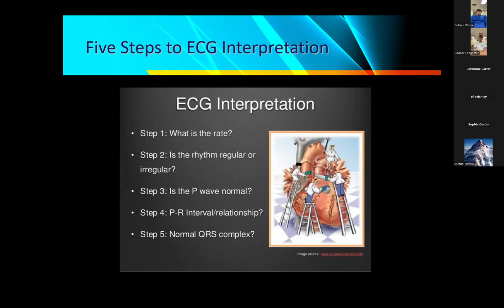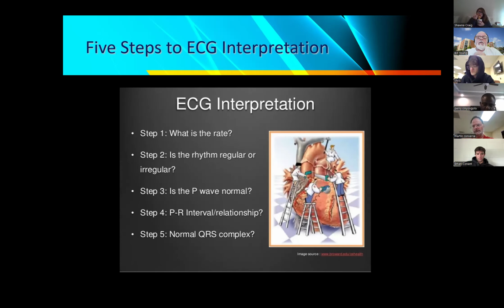All right, then we look at the PR interval. So we identify the PR interval. Let me go back here to the beginning of my listing. So, Shauna, what is the normal time length of a, I'm sorry, no. Finish eating. Marty, what is the normal time width of a normal PR interval? 0.12 to 0.20 seconds. Or how many milliseconds? 120 to 200 milliseconds.